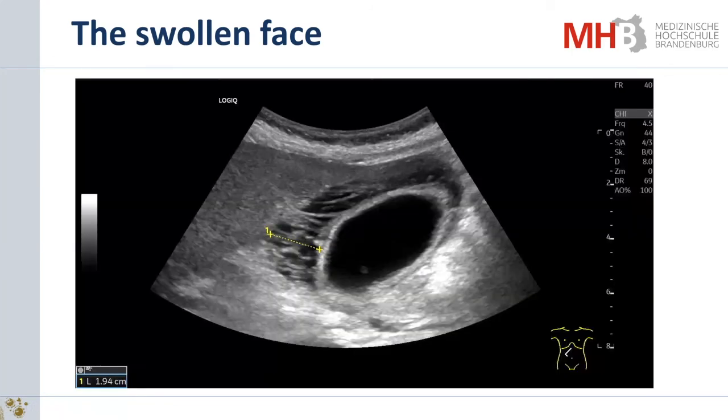Same diagnosis as in the young lady, but he is painless, and he has no elevated inflammation parameters. Edema. Yes, this is non-inflammatory edema, and we have that, for example, in patients with a very low protein amount in the blood, or in patients with liver cirrhosis. In this case, it is not so often to be seen, but in very acute types of hepatitis, for example, in dengue fever or in acute hepatitis A, we see such maximum edema of the gallbladder wall.